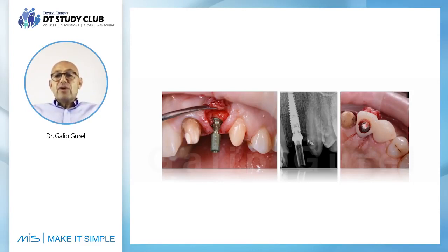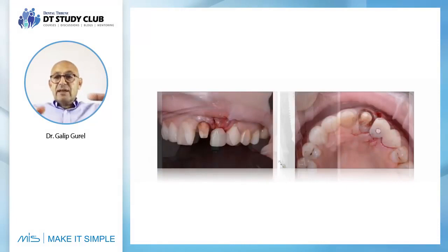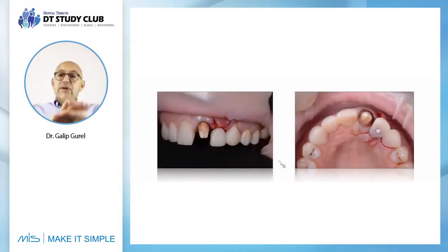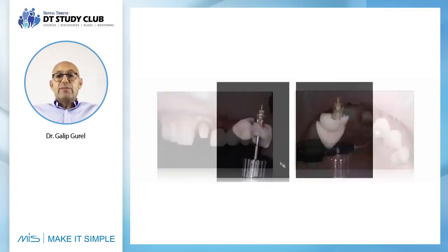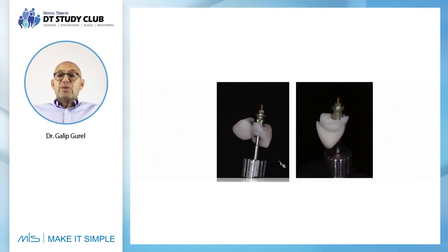And you see the connect in here, which gives me this extra beautiful contour that will carry all the procedure up to the soft tissue level. So we place the provisional, we capture it with composite, and this is what we do.